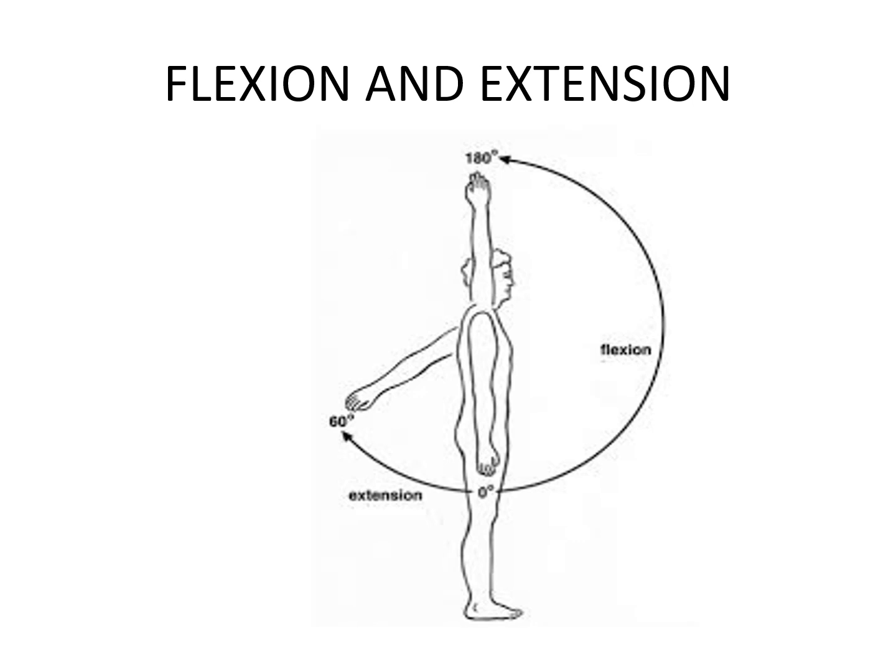Now coming to extension. So you see the figure carefully. And you can see that 0 degrees is the neutral position of the shoulder. When you start from that position and you take it anteriorly, till the level of head, above head, that is 0 to 180 degrees, that is flexion. And then you come back to 0 degrees again. Now from 0 degrees, taking the arm backwards is extension.